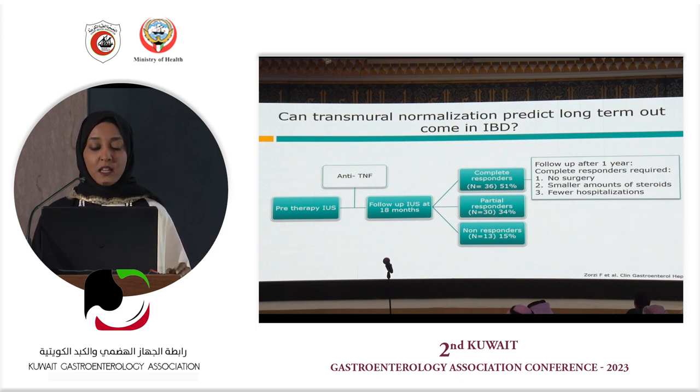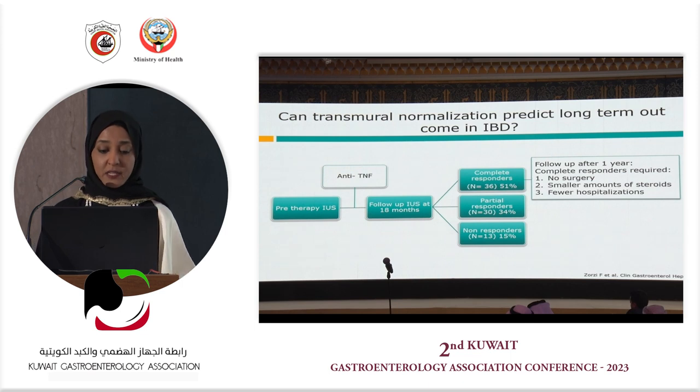So this is a nice Italian trial that was published in 2020, and they included patients who had Crohn's disease, mainly terminal ileal Crohn's disease. They did ultrasound at week 0, introduced anti-TNF medication, and followed the patients for 18 months. After that, they subcategorized the patients into three groups: complete responders, partial responders, and non-responders.